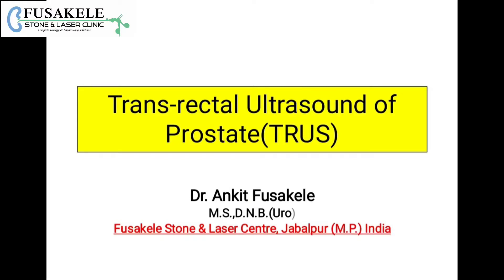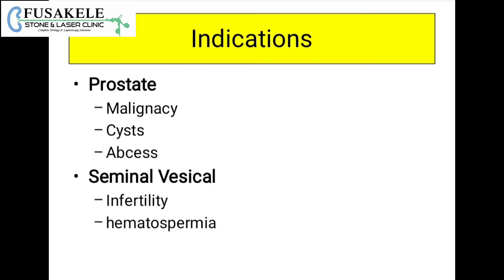This video is meant for demonstration of transrectal ultrasound of the prostate and the seminal vesicle. This modality is important for diagnosing pathology of the prostate, like malignancy, cyst, and abscess, and for the seminal vesicle like evaluating infertility.